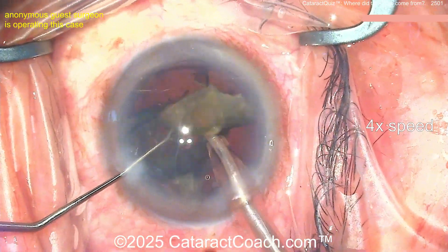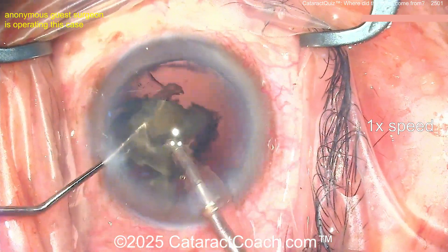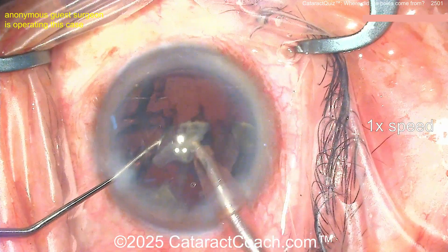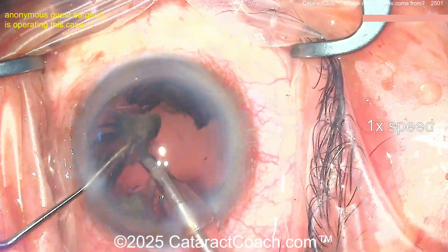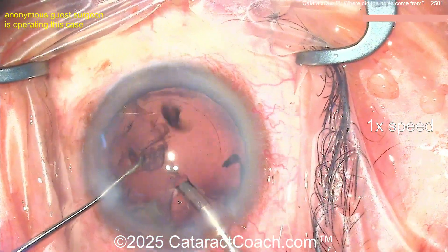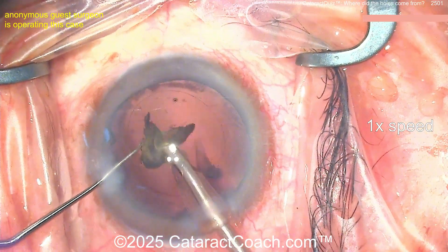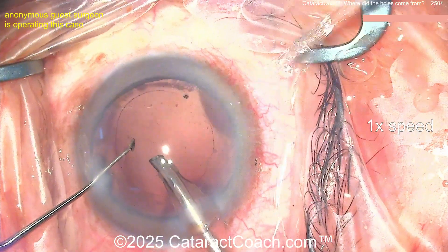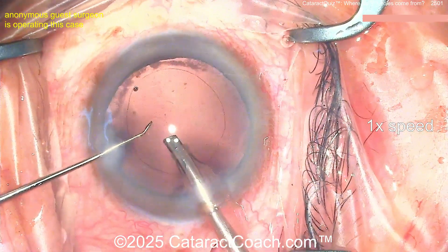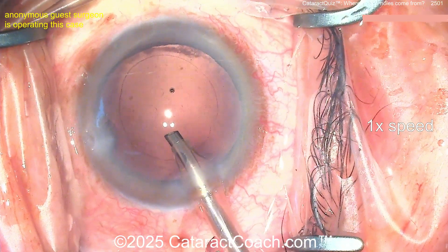So far so good — let me slow down the video to normal 1x speed. Taking out that last piece; the posterior capsule looks okay. The chopper is in that safe position protecting the bag. Removing these pieces — not much cortex remaining. Capsule looks okay, and then taking that last piece — was there something? Yes, there are holes in the bag already. Look at that. Did the capsule bounce up and touch the phaco tip, causing these couple of little breaks? There are clearly two holes — a larger one and a smaller one.